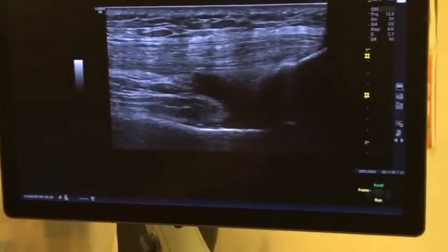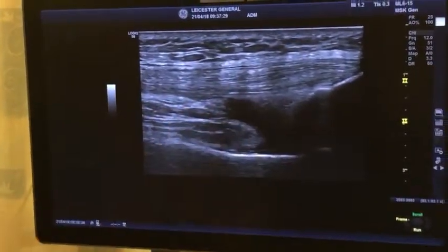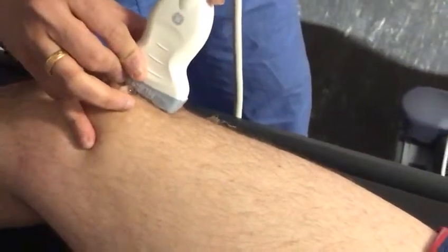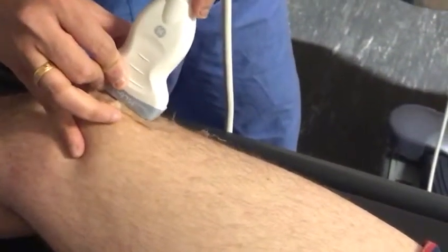You look into the three layers because the medialis and lateralis become one layer. To do the knee joint injection, you can do it two ways: in-plane technique or out-of-plane technique.